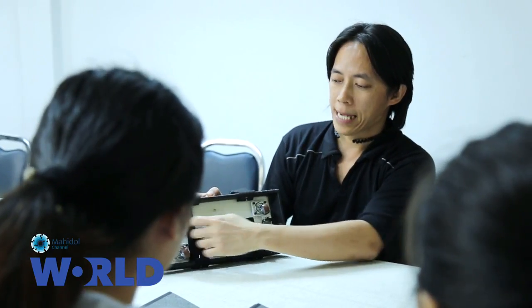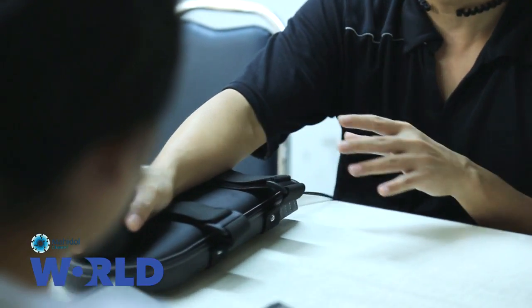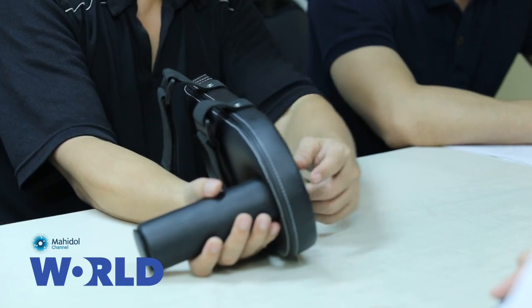The key of our device is that, first, it should be fun to use so that patients have self-motivation. Second, it should be small enough so that they can use it at home. And third, physicians should be able to monitor the usage. We call our device FUGFON.